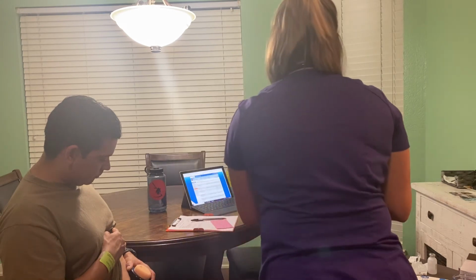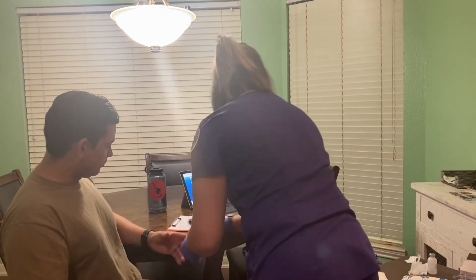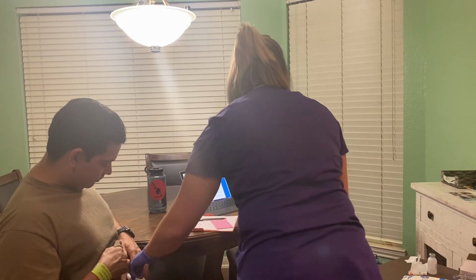And then I'll just put that in a sharps container. Take this. Oh, sorry. And then just hold that there just in case there's any bleeding.